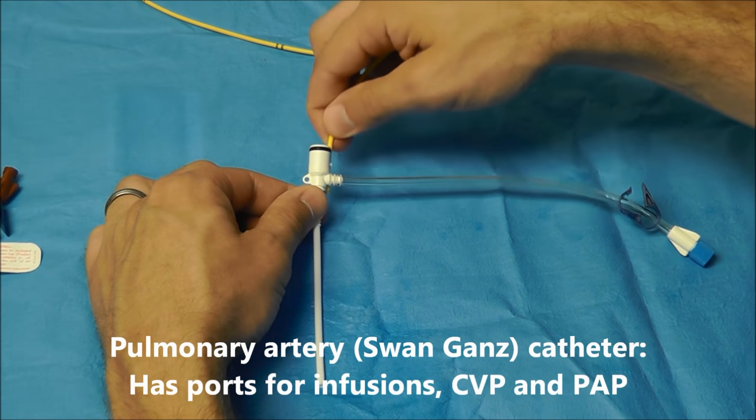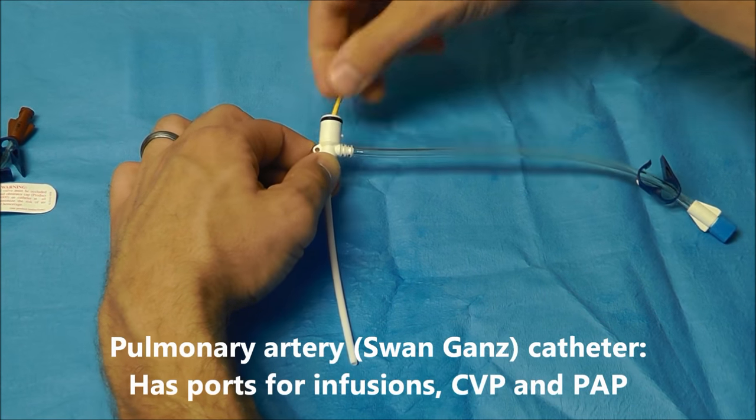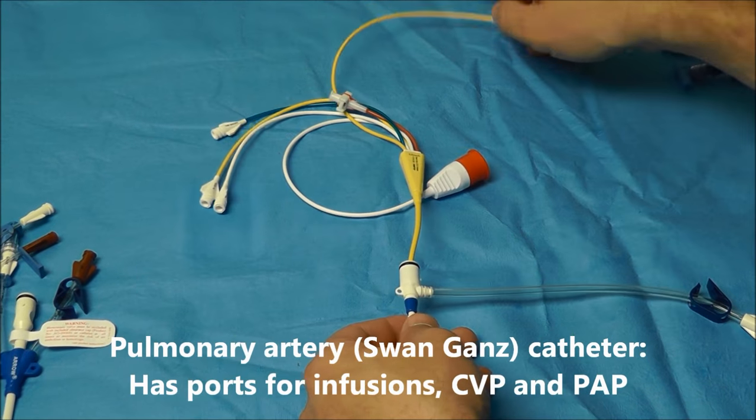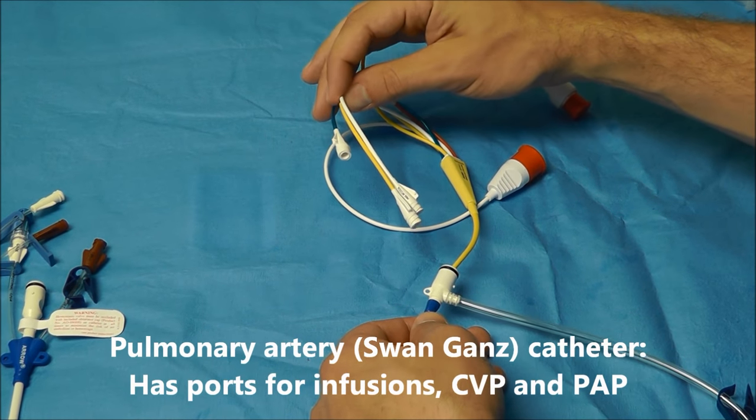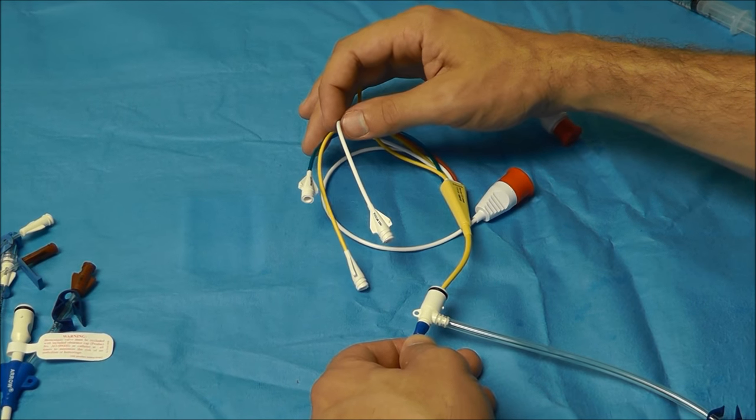And then the last way to overcome your lack of ports is to insert a pulmonary artery catheter. And you can see when this pulmonary artery catheter is inserted, you've got multiple ports for which to use for infusions and monitoring vascular pressures.